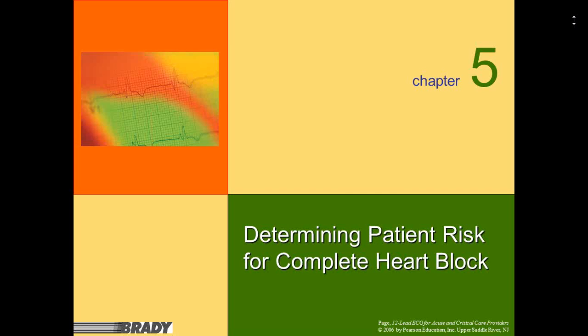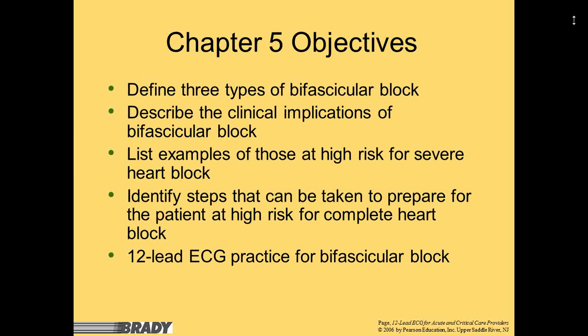Well, here we are, talking cardiology in 12 leads again. We're going to cover Chapter 5, and it's very short. It's things that you've already learned. It's just combining patients that have more than one block. So these are patients that are at risk for a complete heart block, which is a bad thing.